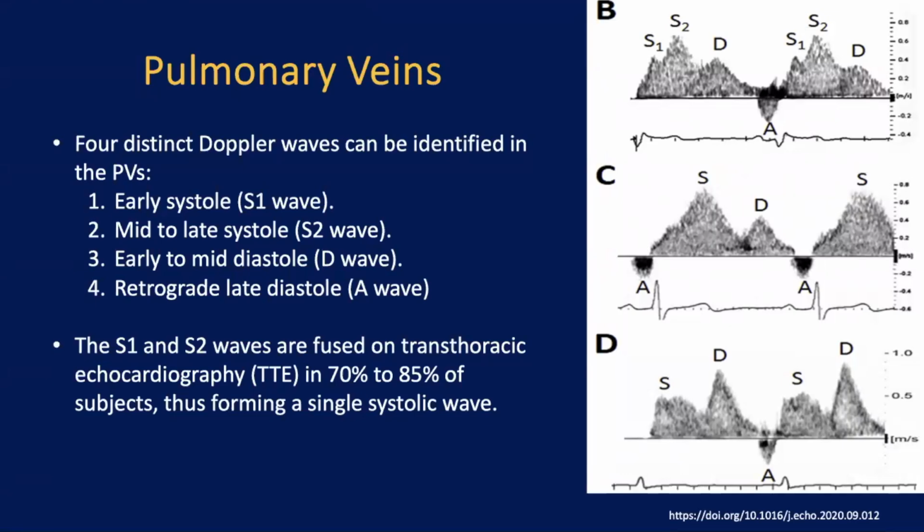No, no. This is yes, but no. Yes, yes, but no. Very smart though, Kat. What's the reason behind the S1 and S2? Let me phrase it, pardon my English. They will say S1... would that be fair to say normally we see only one S, but sometimes we do see S1 and S2 separately with a notch? And what is the condition that actually allows you to see that? Or when you see that, what does that mean? When you see S1 and S2 separately? Normally they're one piece, right?